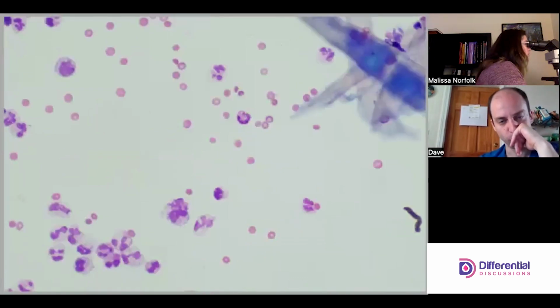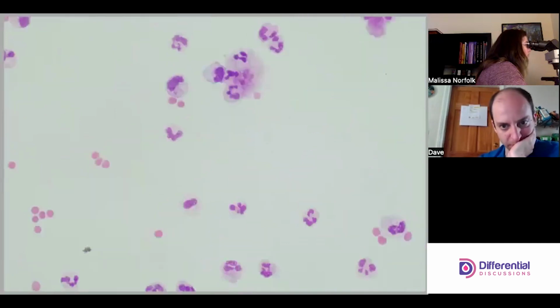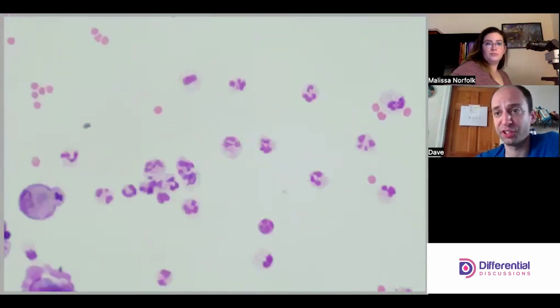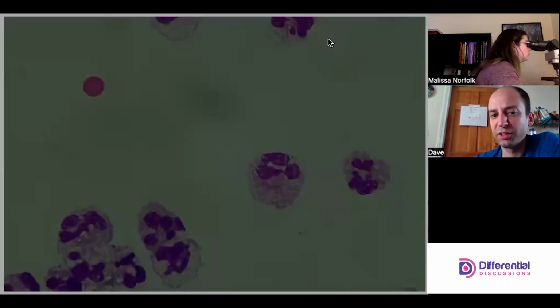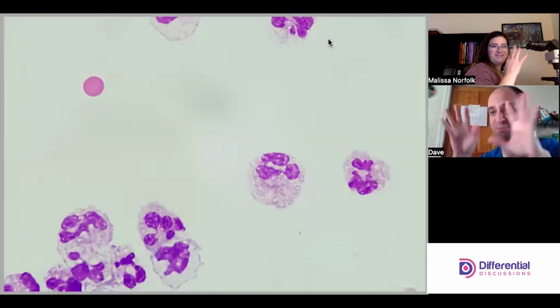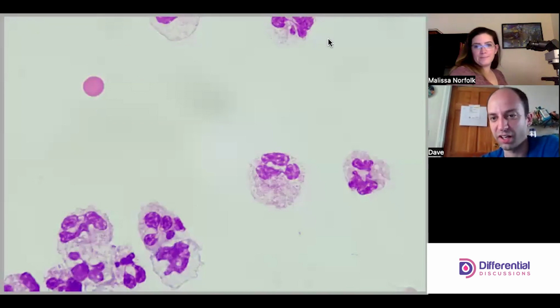Okay, I'll drop down further so that we can look at it on oil. In terms of cells that might be specific to BALs, there's one that stands out in particular, a ciliated columnar cell. If we see one, we'll point them out. You don't always see them in the differential. Sometimes they're hard to pick out if they're recovered at all. My favorite is when you see them on the chamber, when they're still alive and just flopping around. All right, so I see a lot of neutrophils.